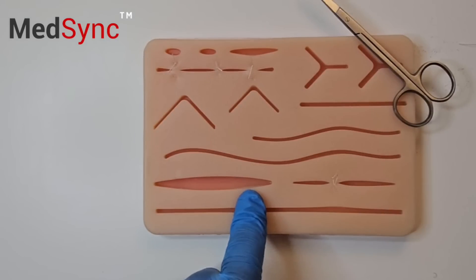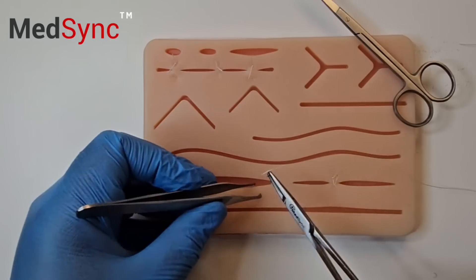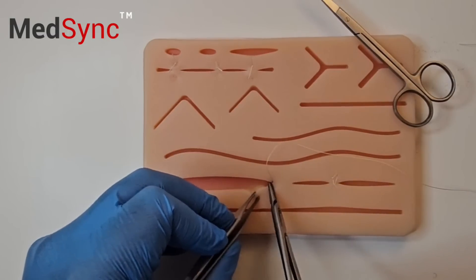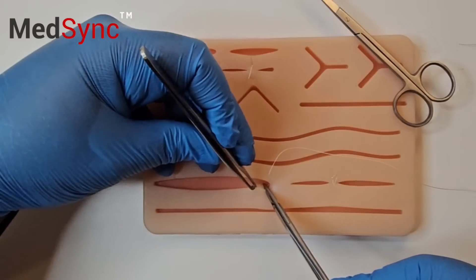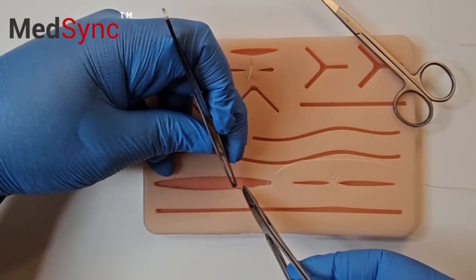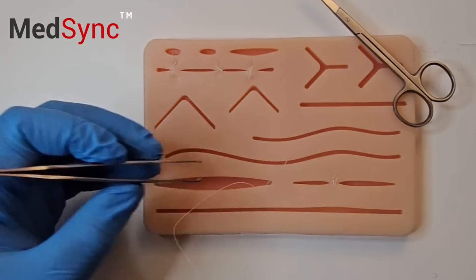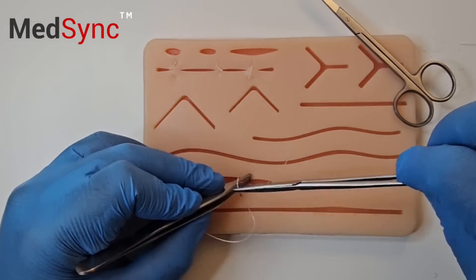Big holes need deeper stitches — the Deep Dermal. You go from deep to superficial, mount it straight away, then go from superficial to deep.